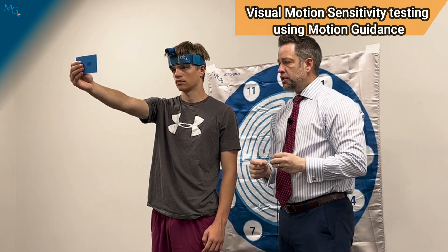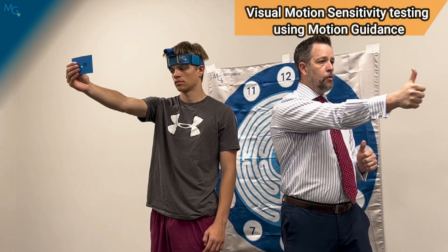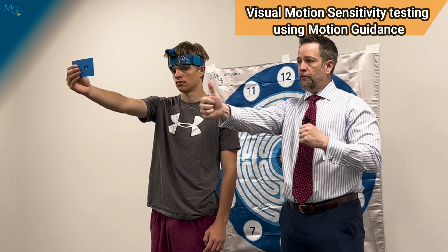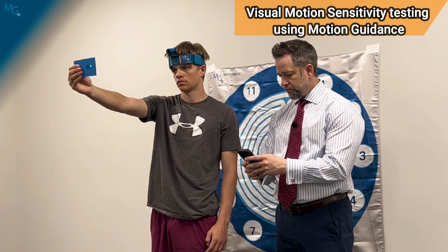For the visual motion sensitivity test, he is going to be performing a full body rotation with the intention of the head and the arm moving at the same speed with the torso throughout a full 180 degree arc at 50 beats per minute. So we're going to utilize our metronome and dial this all the way down to 50 beats per minute.